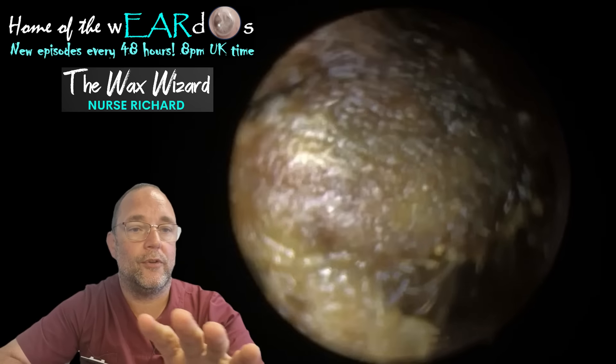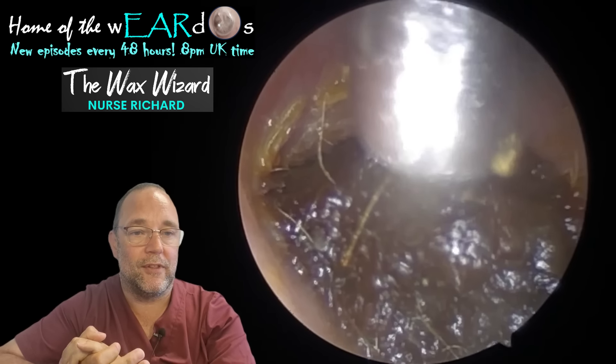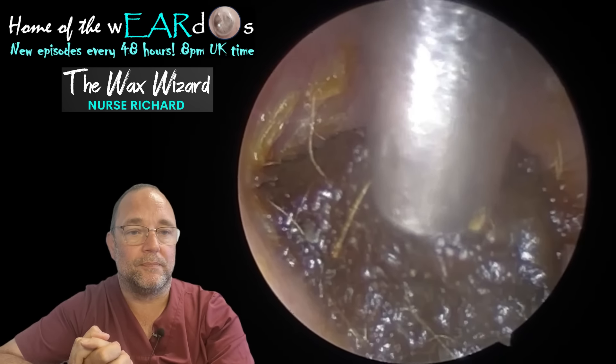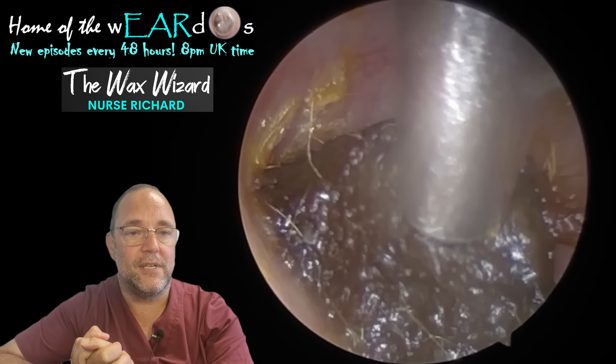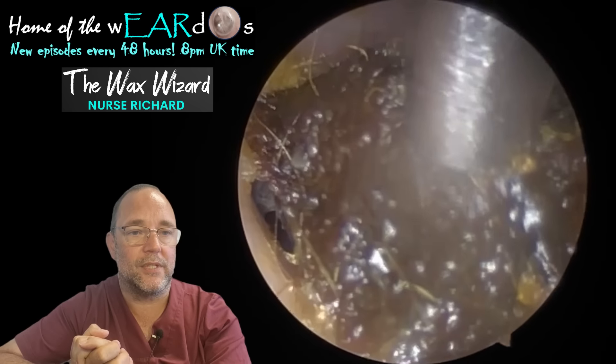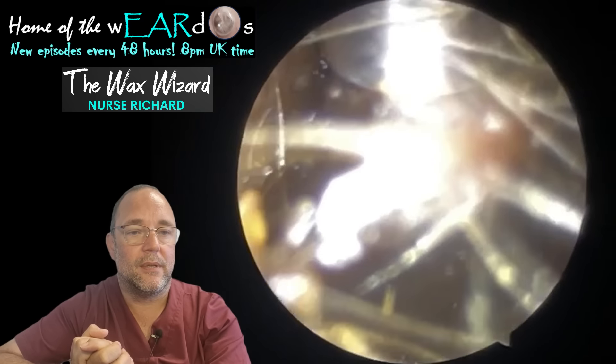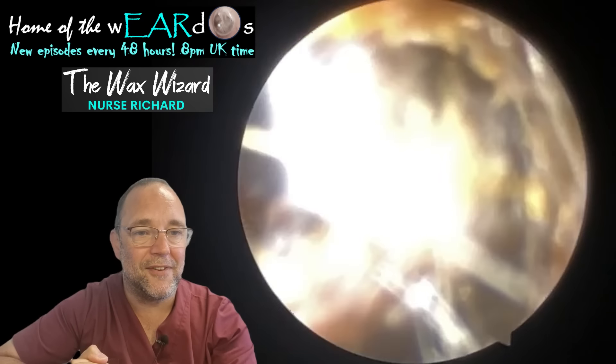While I've been waffling on, you've missed this monster of a removal, haven't you? I thought that was it when that first one came away for this chap, but it wasn't. Again, an incredibly dark, thick chunk at the bottom of this guy's ear, which has just turned itself sideways and popped out. Another Waxed Baby safely delivered.